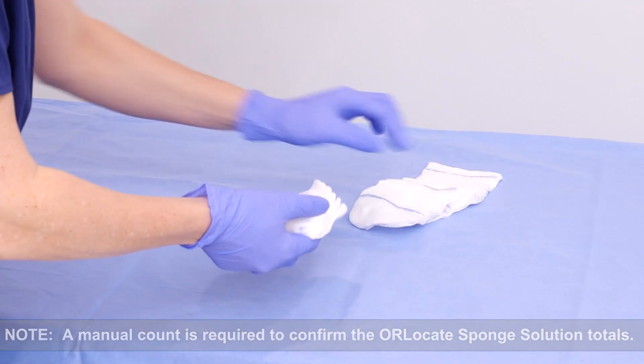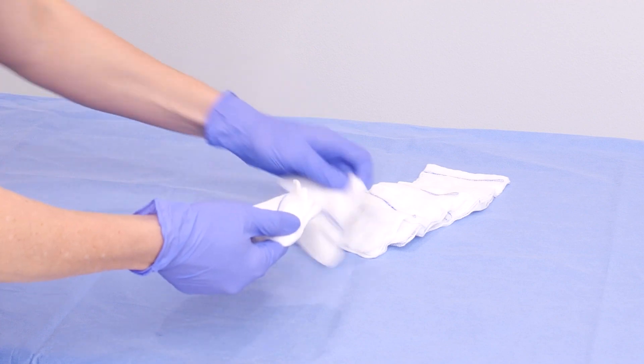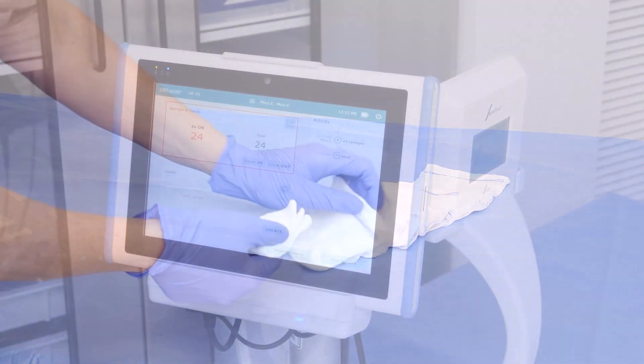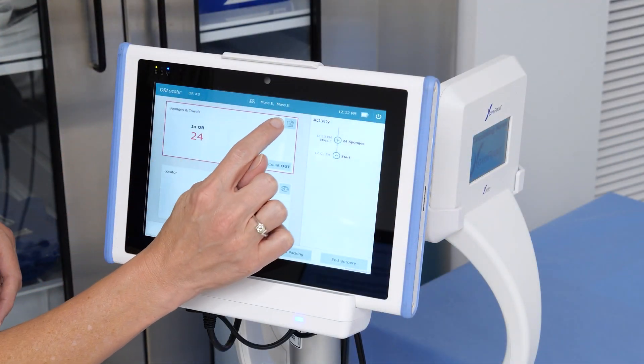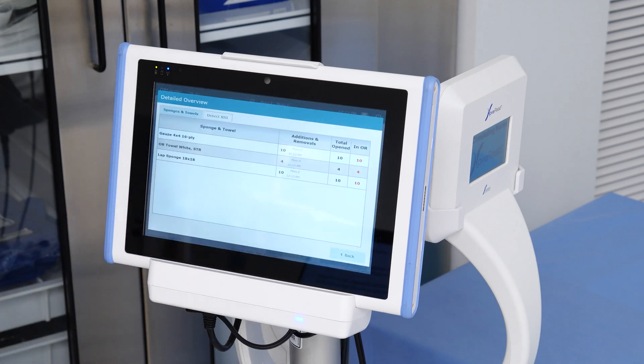You will repeat the count in process if additional sponges are needed throughout the case. To see a detailed list of the items scanned, tap the icon in the upper right-hand corner of the window. A screen will display the detailed list of sponges and towels. To return to the main interface, press the Back button.